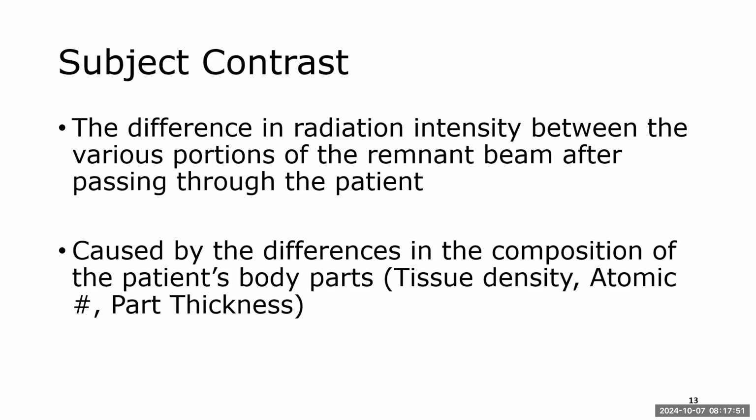contrast, and everything that we used to say about display contrast and film contrast still holds true when we talk about subject contrast. So subject contrast, the definition is the difference in radiation intensity between the various portions of the remnant beam after passing through the patient.